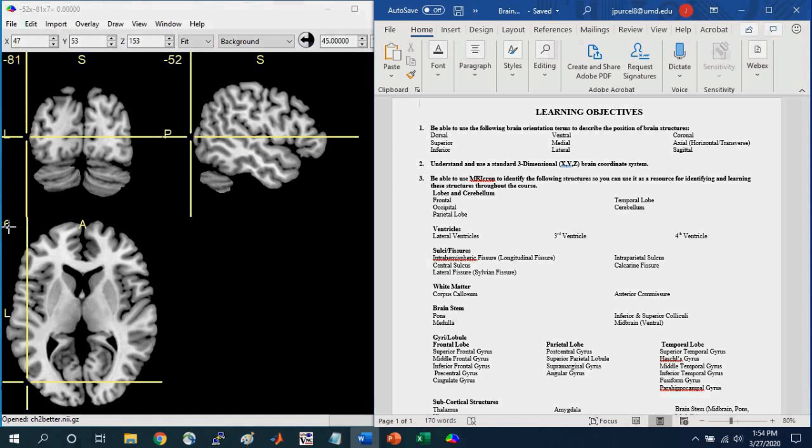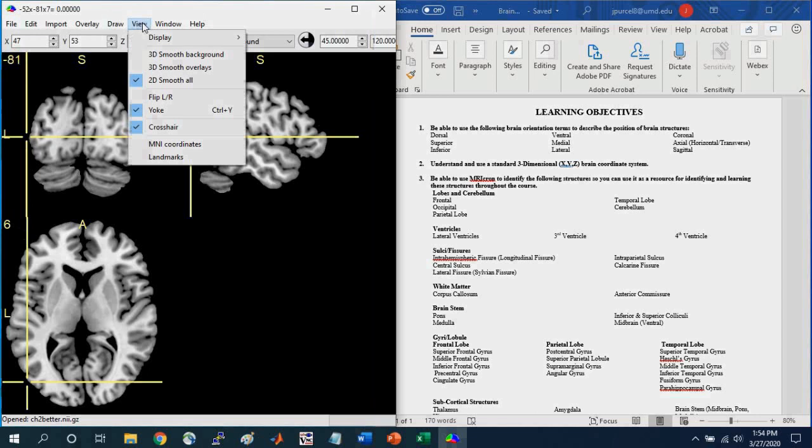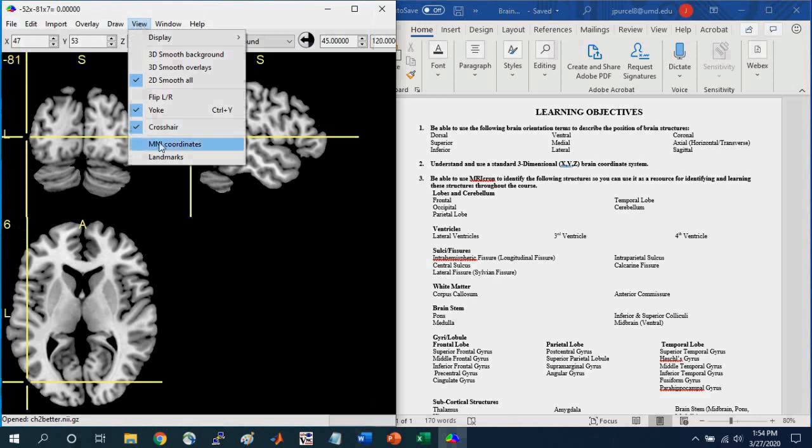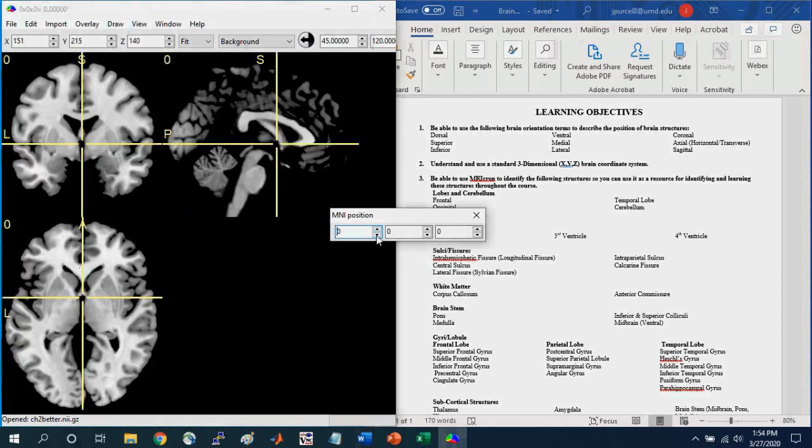And so we can navigate to a specific coordinate by going to view MNI coordinates, and we can input the XYZ coordinate. And so here, by default, it takes us to the 0, 0, 0 point, okay?